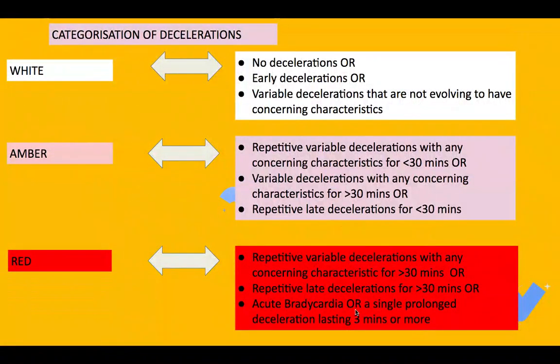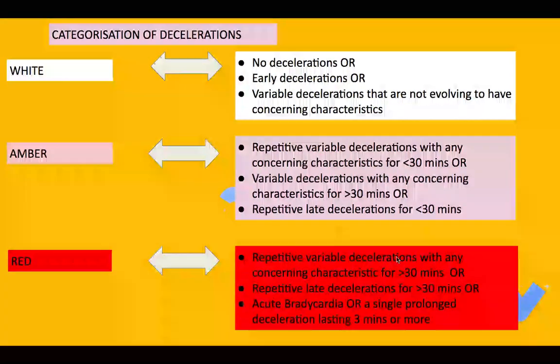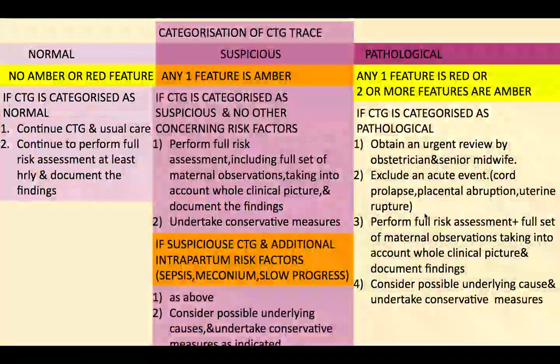And acute brady, everyone knows, there's no need to explain it, that acute brady or the single prolonged deceleration lasting more than 3 minutes is also a bad feature, right? We all are not happy with that.